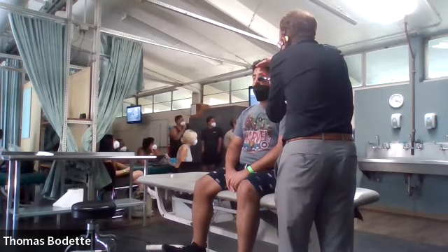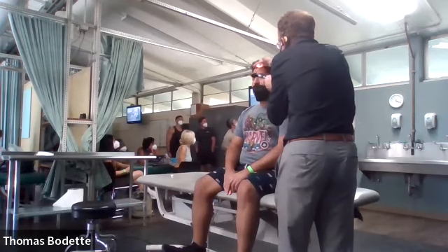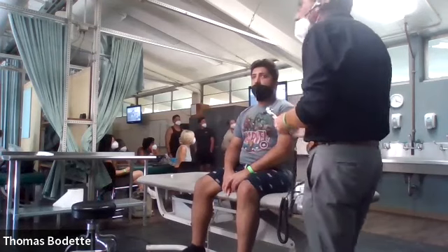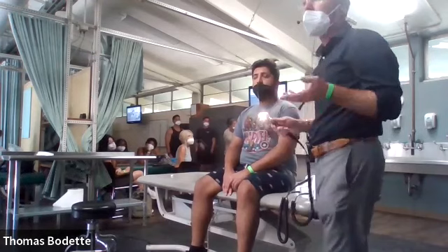So you want to angle it, but not just light the skin. You want to make sure that you're underneath the orbit, and inch your otoscope speculum along so you can see all of the sinus, or as much of it as possible. And as much as I'm trying to shield the light, it's still a little bit hard to visualize.